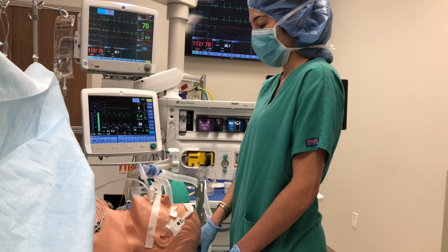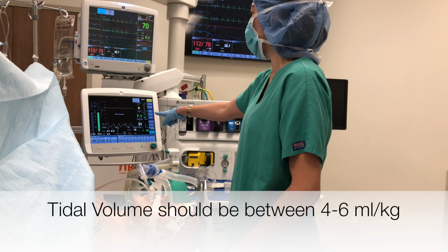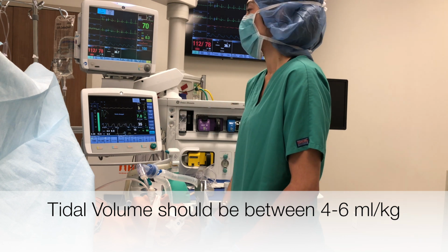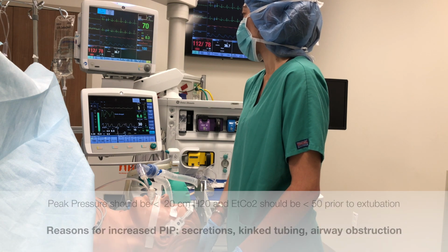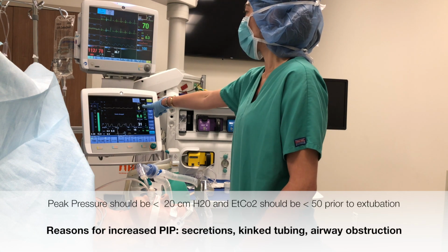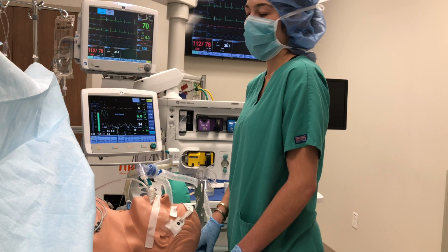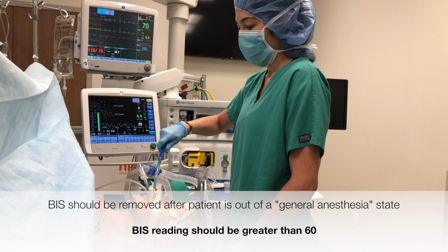Look at the ventilator monitor. Make sure the patient is pulling adequate tidal volumes. The patient should be pulling volumes of 4 to 6 milliliters per kilogram. The patient should also have normal peak pressures and normal end-tidal CO2. Suction the patient's mouth, remove the bite block, and remove tape from eyes.